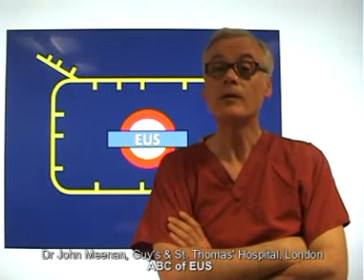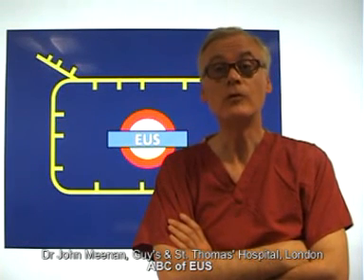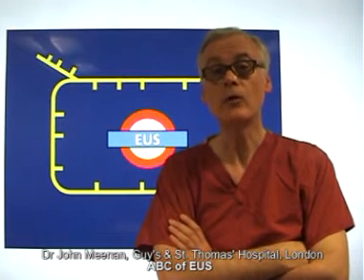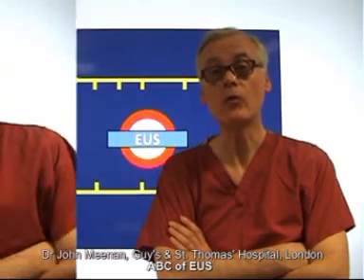Nobody ever said that learning EUS was easy. Nothing can replace a good teacher looking over your shoulder, but we also need guidance that we can follow at our own pace and in our own time. And that's what the ABC of EUS is all about.